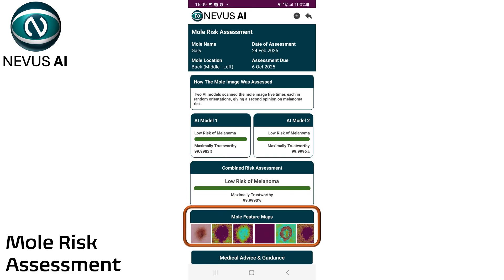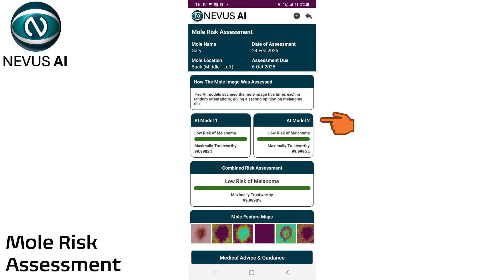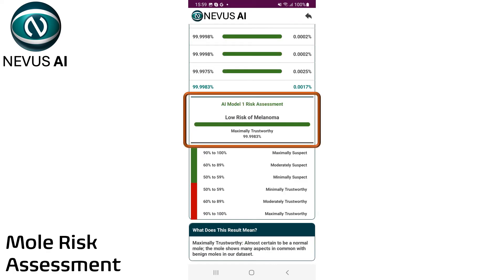Nevis AI generates a series of feature maps, showing aspects of your mole that were used to predict the risk for melanoma. And based on the results of your risk assessment, Nevis AI recommends whether to seek professional medical advice, and how often you need to monitor this mole. Tap on the AI model assessment to see the risk scores for each individual scan of your mole, to see how the final risk score was calculated.